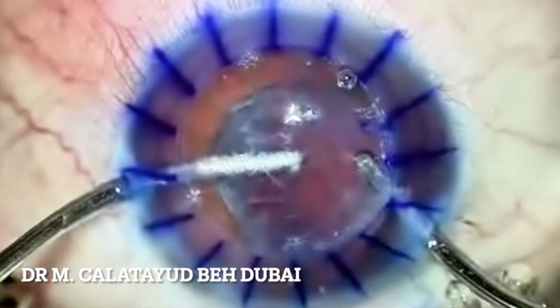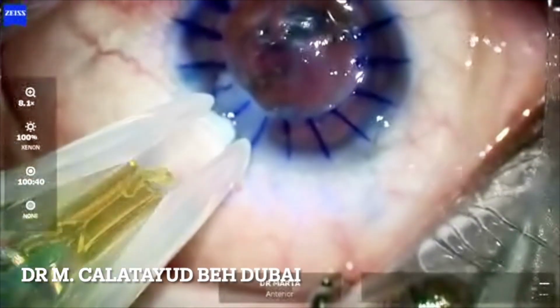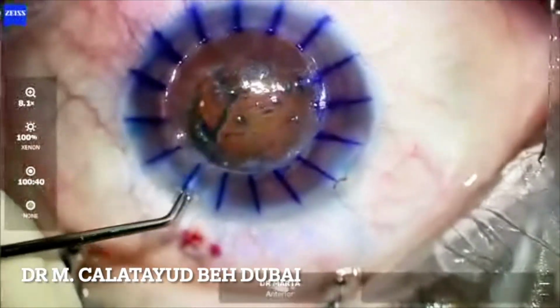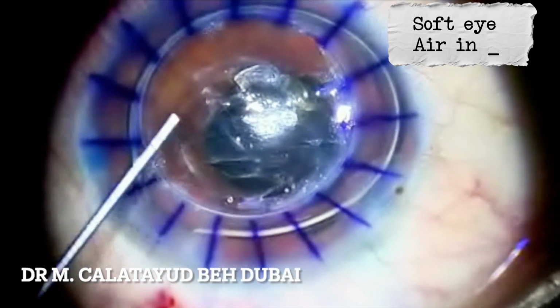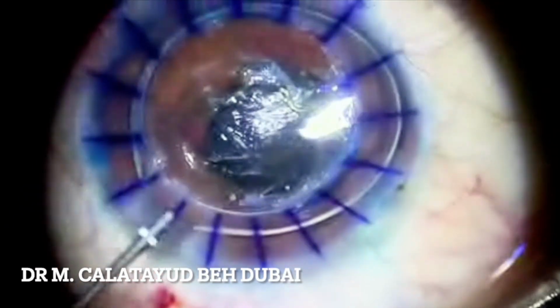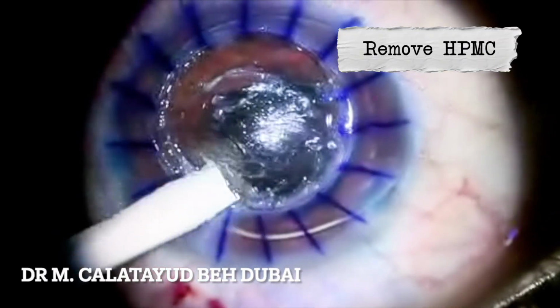In cases like this, IOL power calculation is intrinsically less predictable. So we calculate the lens power according to axial length and standard keratometry. I don't close the surgical wound to be able to manage intraocular pressure. The softer the eye, the less risk of converting to penetrating keratoplasty.